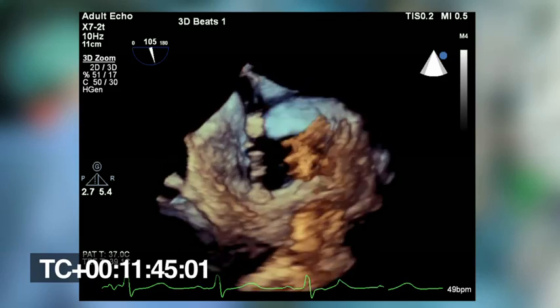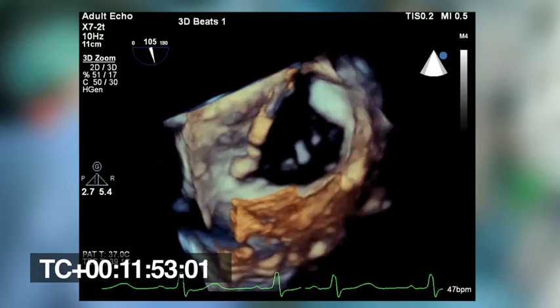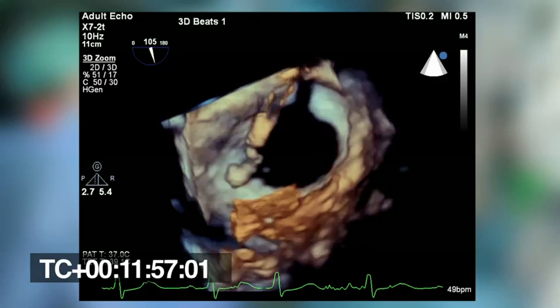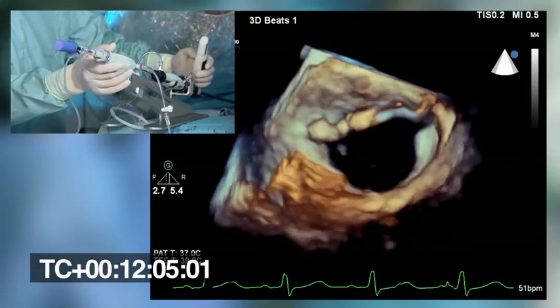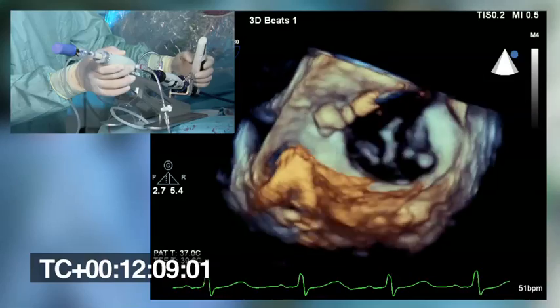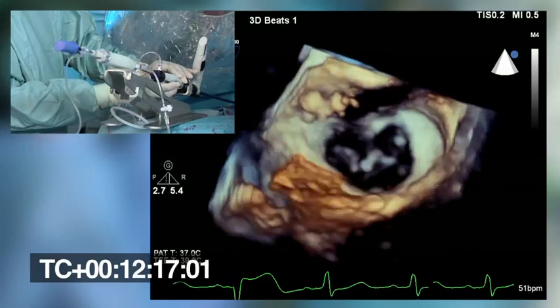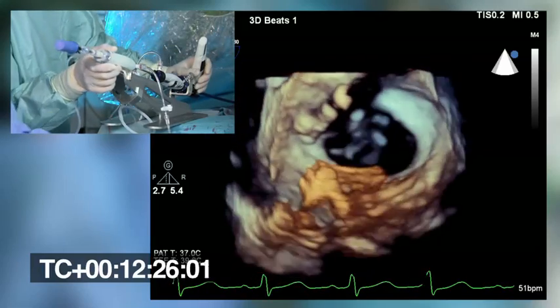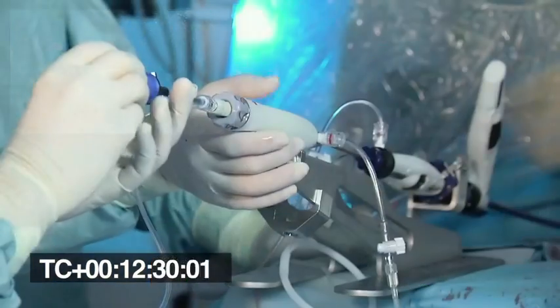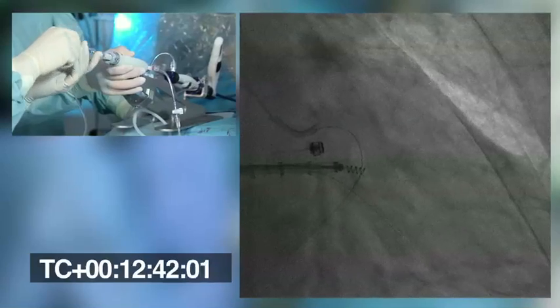With fine maneuvers we can get into the annulus in this region. It is very important at this time to mobilize the spool so we clearly identify what is the implant catheter and what is the spool. I am moving the spool back and forth — we can also see this on fluoro. The implant catheter is a few millimeters away from the annulus, in a curve at about 45 degrees to the annulus. By straightening the TSS I can go more anterior, then bend the guide catheter clockwise to go lateral. I'm now more anterior and happy about the position.